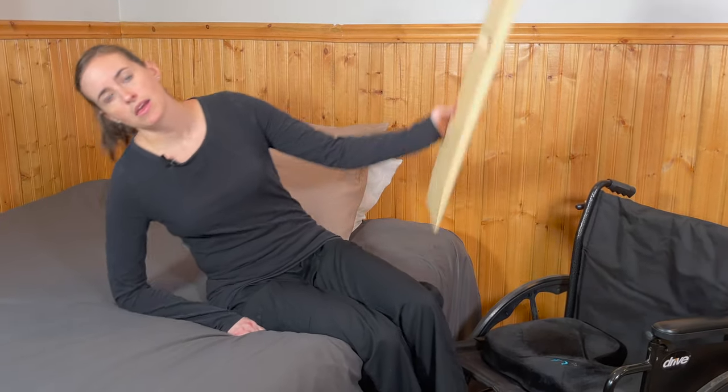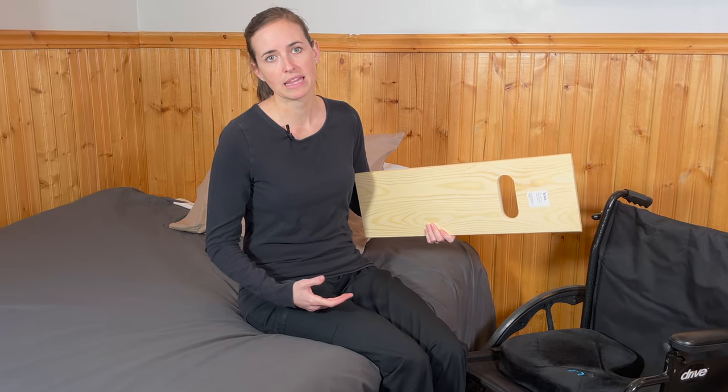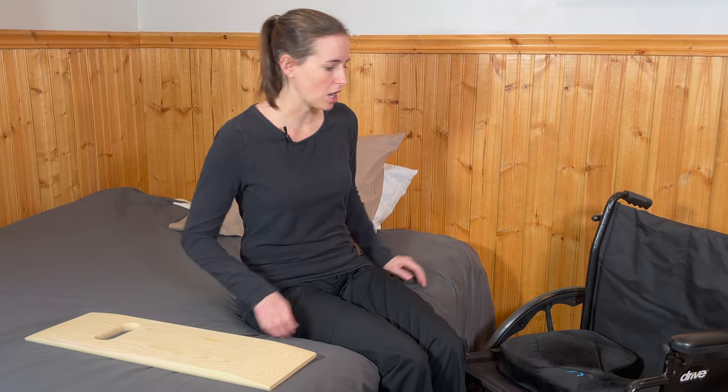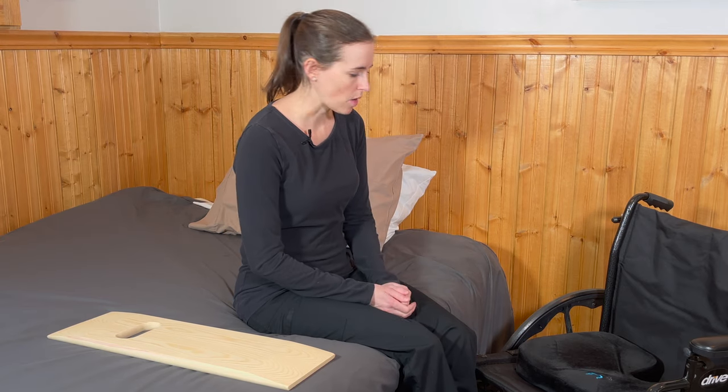Now complete the slideboard transfer by slowly pushing yourself up to the bed surface. Then simply lean away and pull the slideboard out. No weight bearing through the legs is required — the slideboard effectively allows you to transfer up. Then complete your bed mobility: laying down, adjusting your legs, and so on.